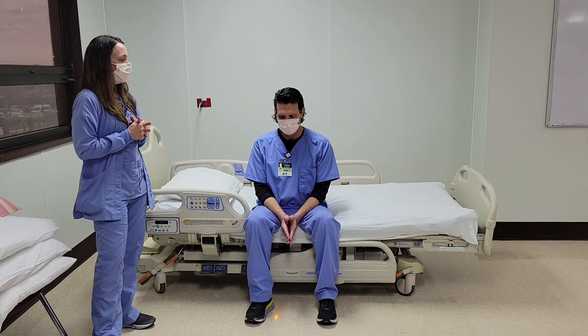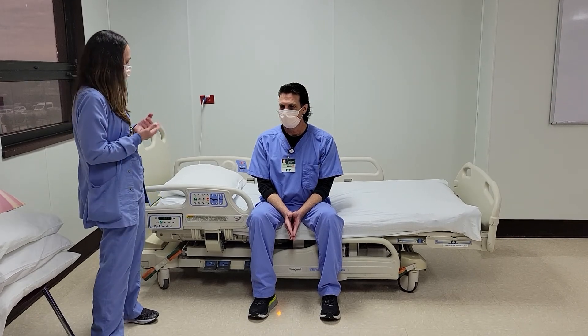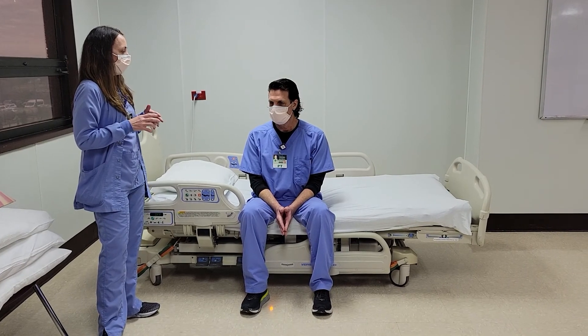So if you run into that instance, keep in mind you'll have to order another bed. We're going to go right into positioning your patient, getting in bed, and safe positioning.